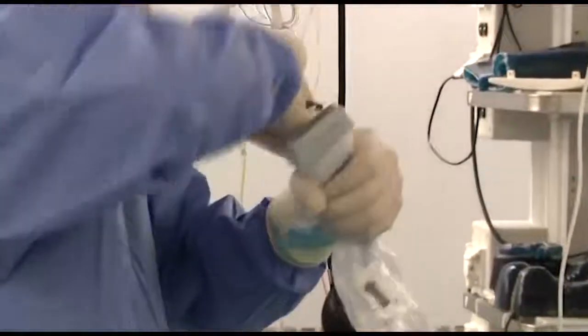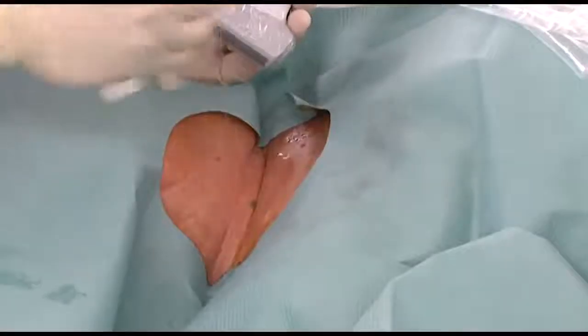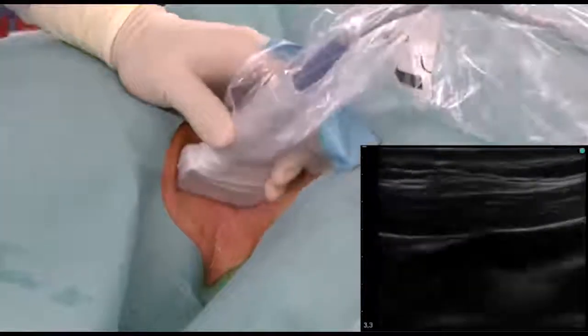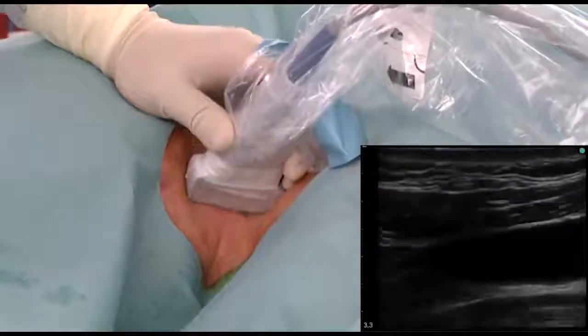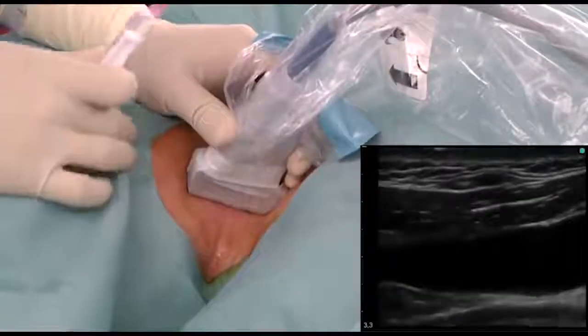Using sterile saline solution as a coupling medium, the internal jugular vein is relocated on the long axis. To minimize the risks arising from possible posterior vein wall puncture, it is better to avoid the planes in which the carotid appears underneath.